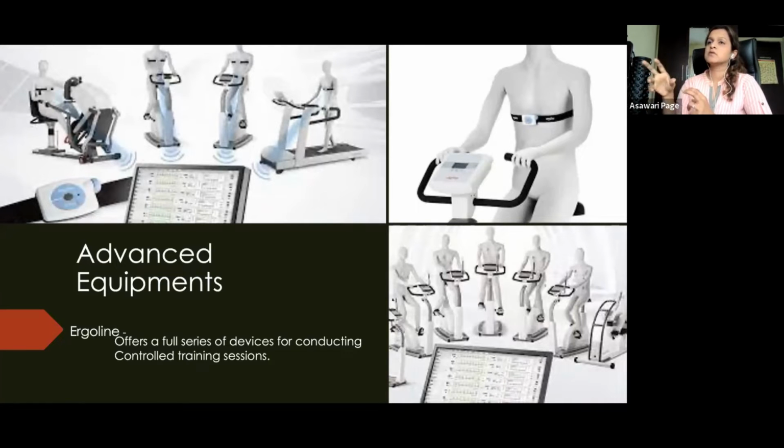Say, for example, if the person shouldn't go beyond 120, then it will sense that and automatically bring the speed down when the person reaches a certain heart rate. Or if you want to get it into just a training mode, there are so many various modes of software in that thing, but it's extremely expensive.